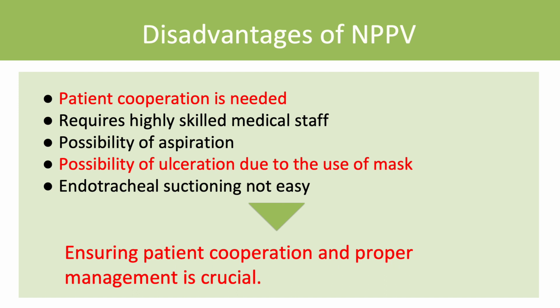The disadvantages of NPPV are as listed in the slide. The most important thing in performing NPPV is the patient's understanding about the treatment and the proper management while performing NPPV. Also, thorough explanation to the patient and management, including mask fitting, are the factors that bring out the effects of the treatment.